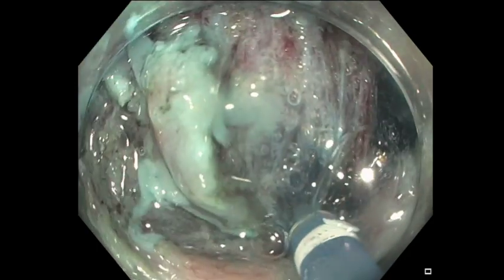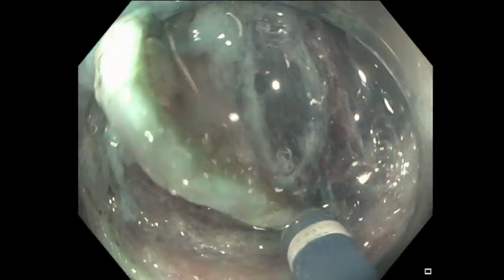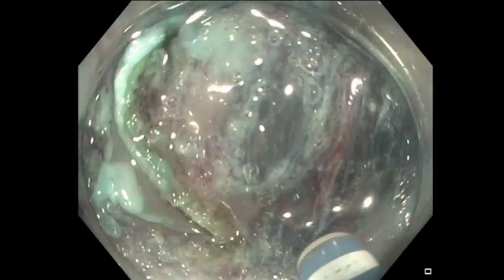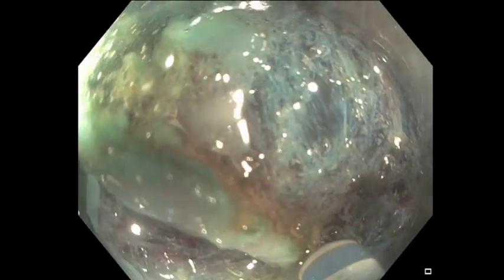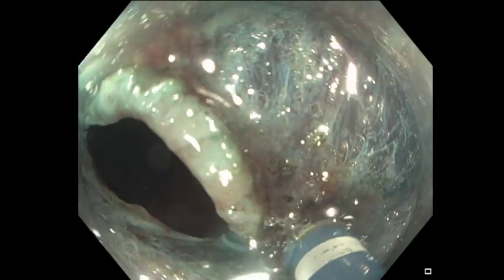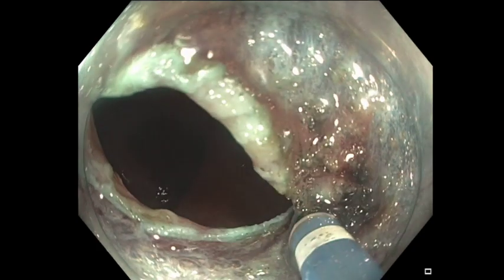So now we dissected in the front of the fold, going beyond to the back of the fold. And you can see now we reach the end of the lesion on one side. And this is good news, because the moment you reach the oral side of the lesion, which is the distal part from where you are looking, now you know that you can utilize that back margin that you created at the beginning and go from one side of the lesion to the other.